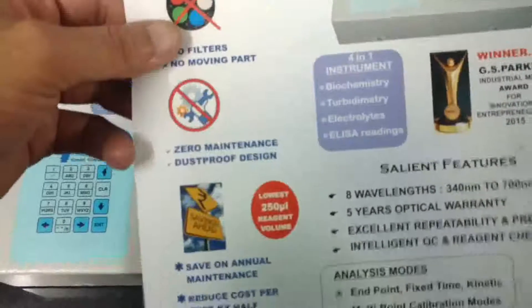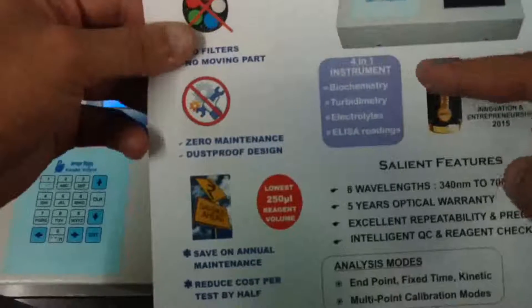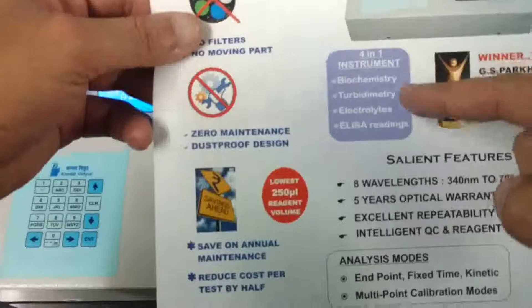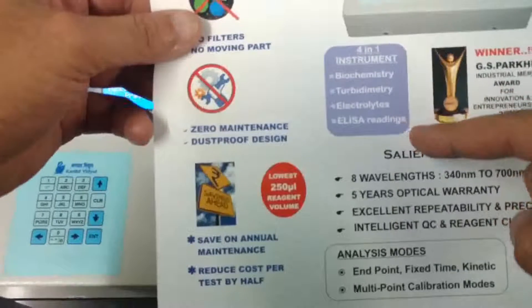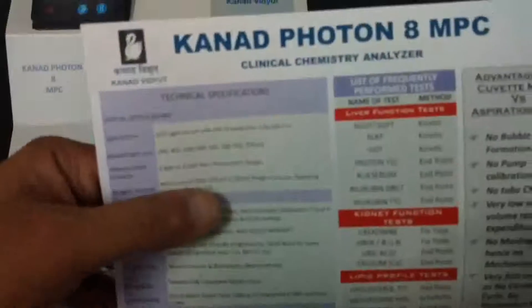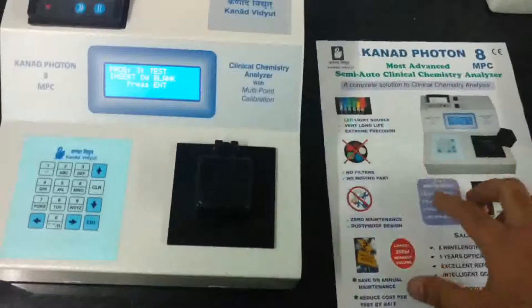This machine can perform four different types of analysis in a single instrument: biochemistry, turbidity, electrolytes, and ELISA readings. On the back side you can see the test menu listing all tests performed by this machine. It also includes HbA1c and ELISA readings.